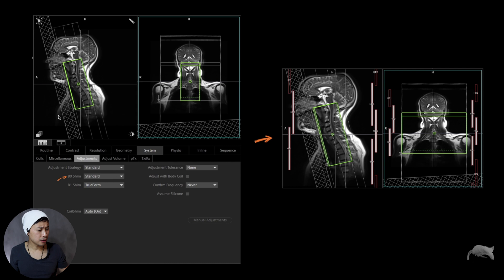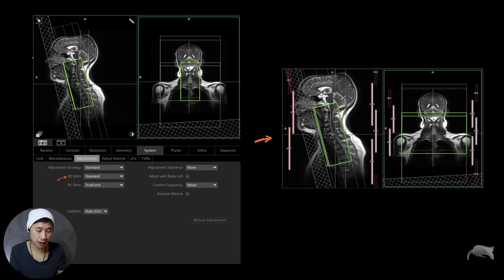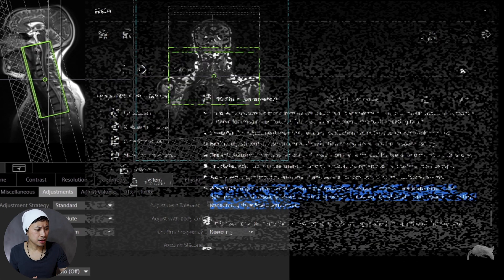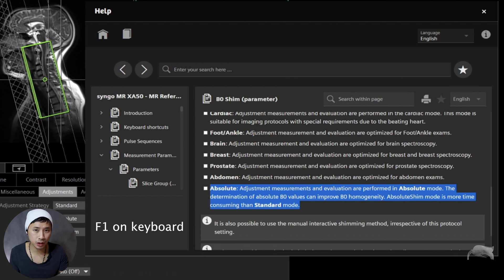Then it came to my mind: why is this shim box so small? I really wanted to cover the whole field of view, so I extended that box to cover the whole FOV. By doing that I was also hoping it might help with the inhomogeneities. And the last thing we did was using Absolute mode. Absolute mode is something new for me — I had never seen it before until we got the XA platform.